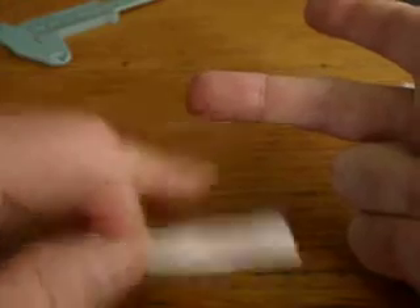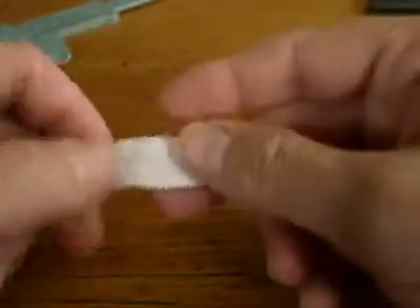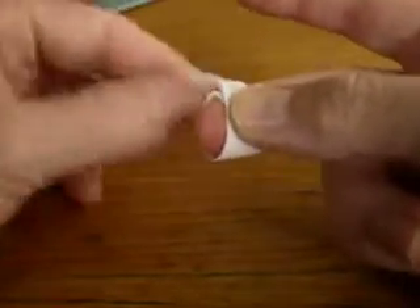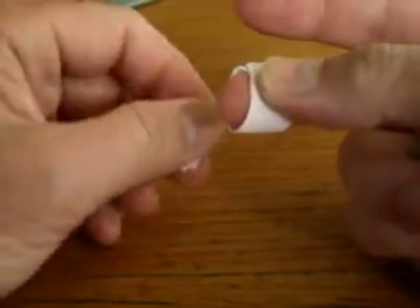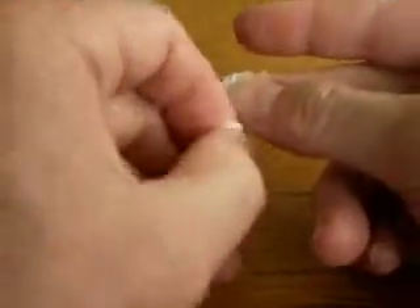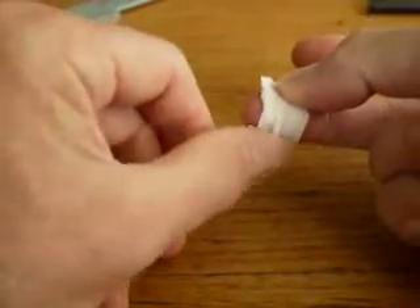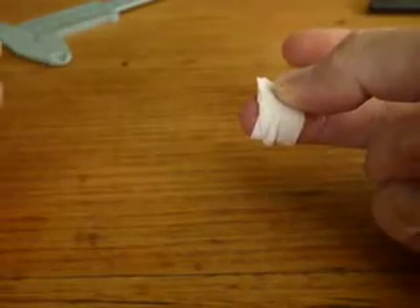Normally I lance my finger along this side, or that finger, or that finger — it just depends. To apply my new little bandage, I just wrap it once around like that and hold that. Then I give it a bit of a twist to make the part that's going to go at the back stronger, so I can actually put pressure across exactly where the lancing point is.